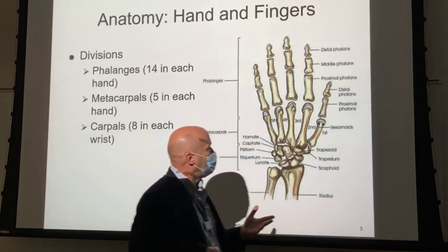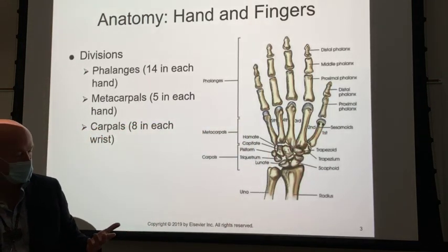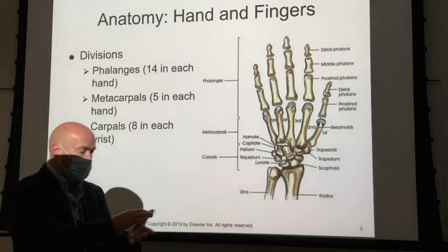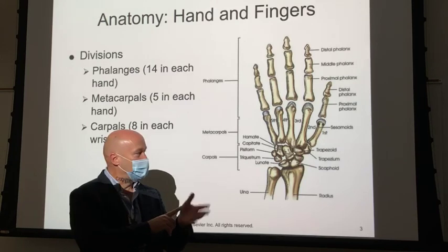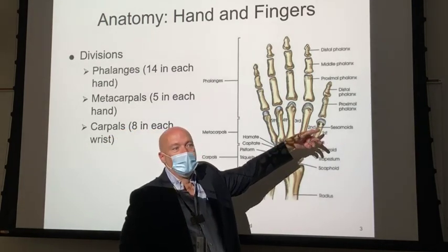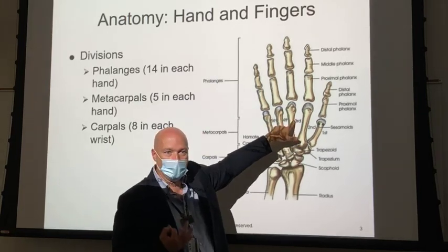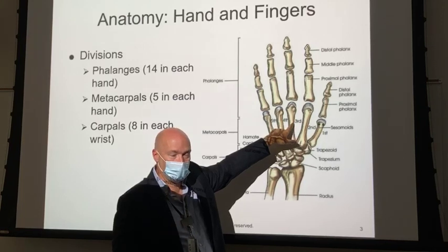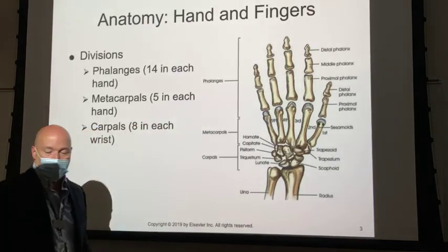So when the patient mashed their thumb, but it's not really the thumb, it's proximal to the thumb in their hand, your history would say injury to the first metacarpal, right? And if they mash the middle of their hand, that would be which one? Third metacarpal, right?